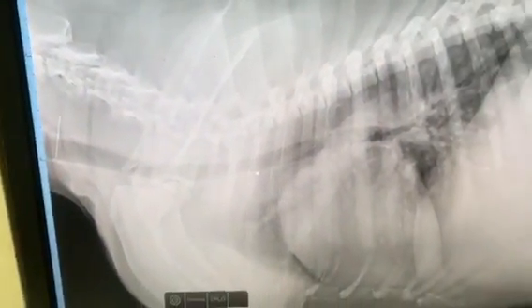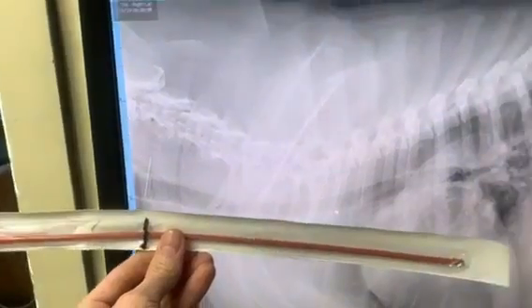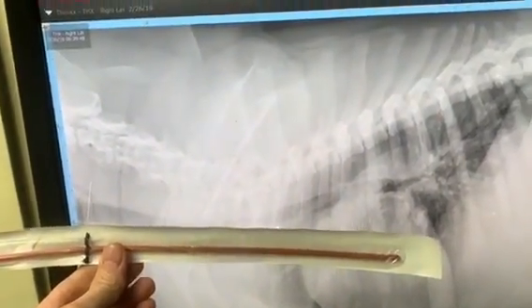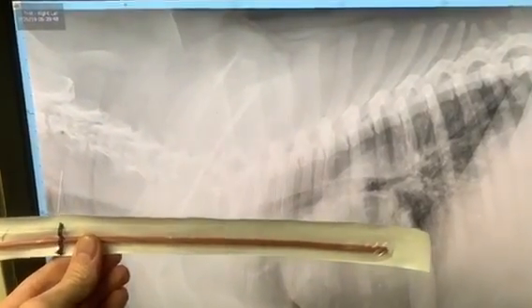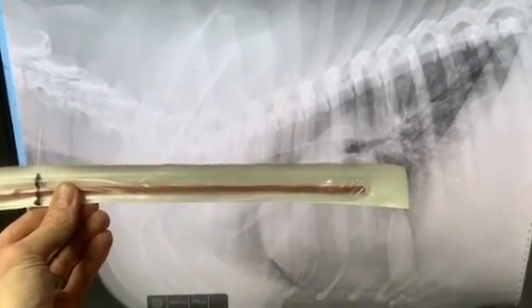Here are the x-rays of Cheyenne. As you can see, we have some pretty severe vascular congestion. We've also marked the x-ray with a needle, because typically the spot where we find the most worms is right around the carina. We pre-measure with our catheter from that pre-marked spot, mark the skin with a sharpie to note the insertion point, and measure to approximately the level of the carina. This gives us an indication of where to expect the worms when we go in surgically.